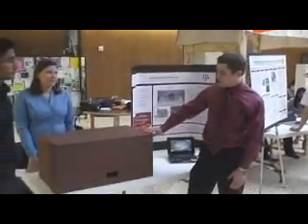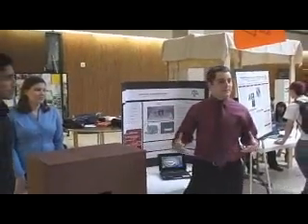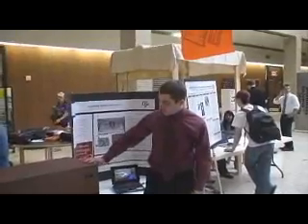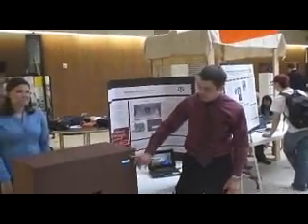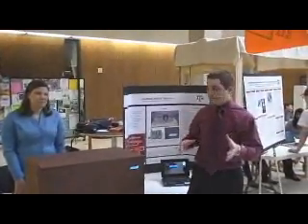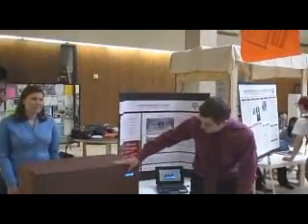This is our medical dispenser. It's a little bit big in size, but that's because of mechanical limitations. So basically, you have your on-off switch here, it'll power up, and all of it starts off at 12 o'clock at midnight, and then you can set your clock with the hour and minute pin.